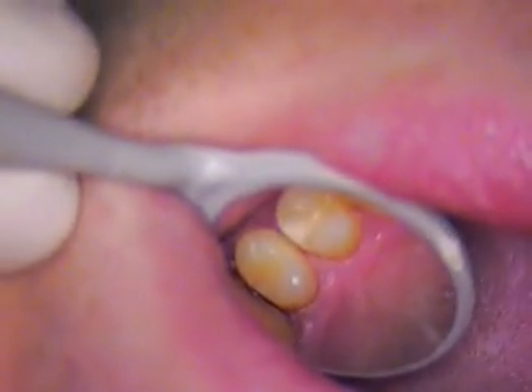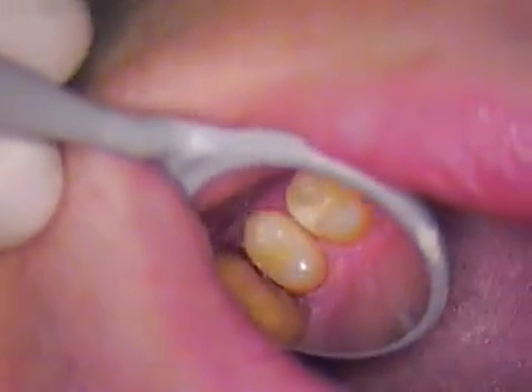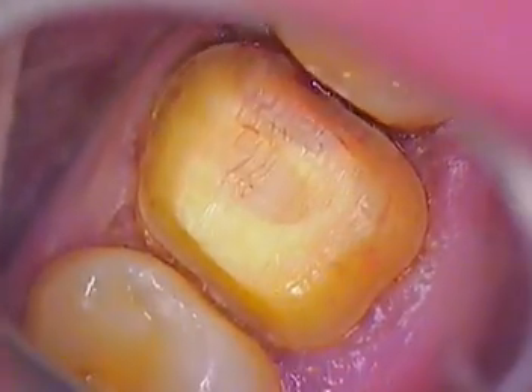Hello and welcome back to our third segment of Oleg's case. We're going to go ahead and finish up his preparation now. I'm going to work a little harder on this lingual, finishing it up by getting the margins perfect, and we'll move right to the buccal.